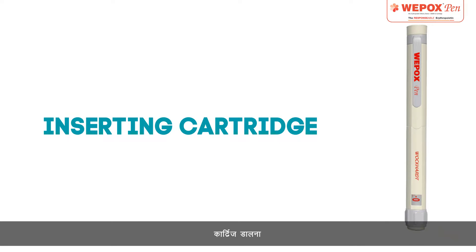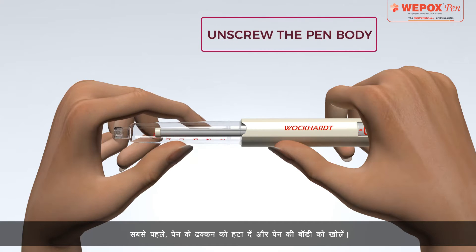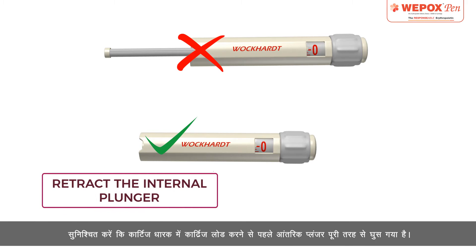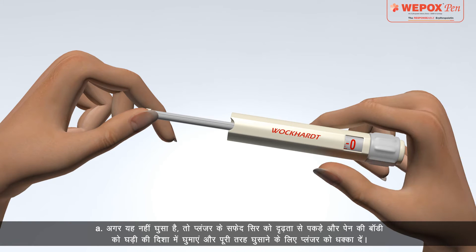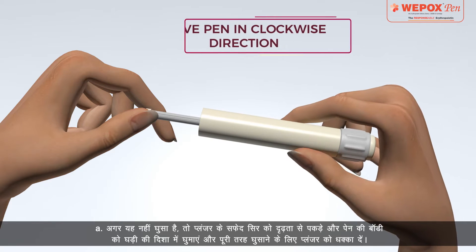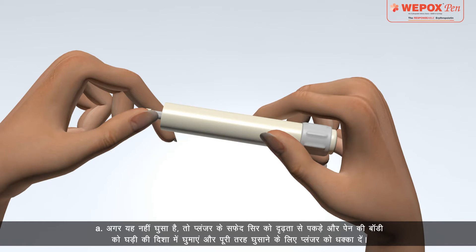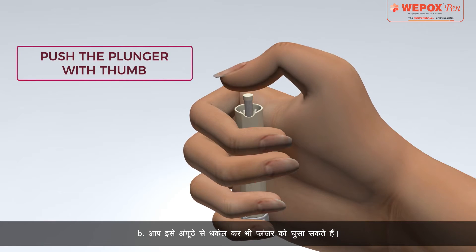Inserting Cartridge: First, remove the pen cap and unscrew the pen body. Ensure that the internal plunger is fully retracted before loading the cartridge into the cartridge holder. If it is not retracted, hold the white head of the plunger firmly and rotate the pen body in a clockwise direction and push the plunger for complete retraction. You can also retract the plunger by pushing it with the thumb.